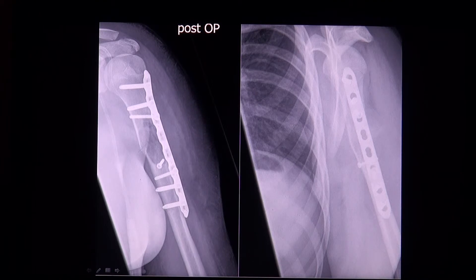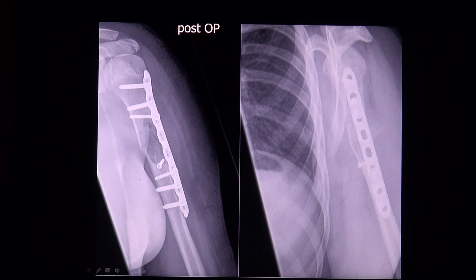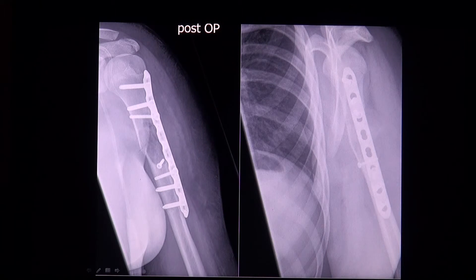Another differential diagnosis is fibrous dysplasia, which contains ground glass density radiographically and has a solid content on MRI. A giant cell tumour, like the aneurysmal bone cyst, is situated more eccentrically, doesn't show a sclerotic margin, and also has a solid content on MRI.